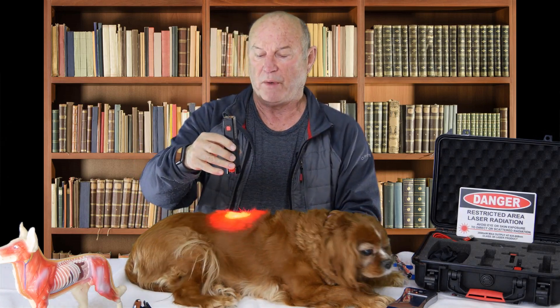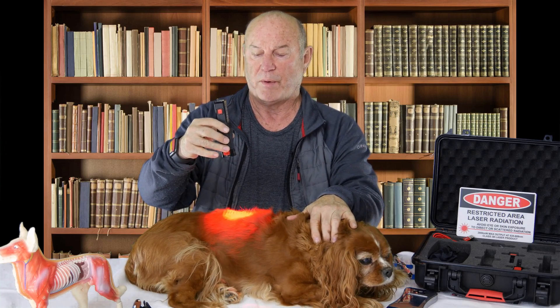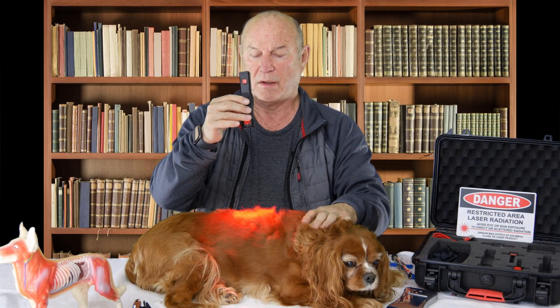Now, as you can see, we can laser this spot. We can use an infrared laser — she's able to feel it, but it's not hot. We can basically use this infrared to take away the pain in this area. What we're actually utilizing right now is this laser at 260 milliwatts.